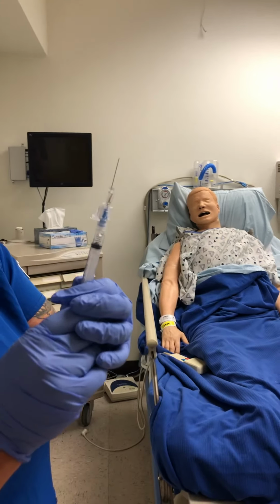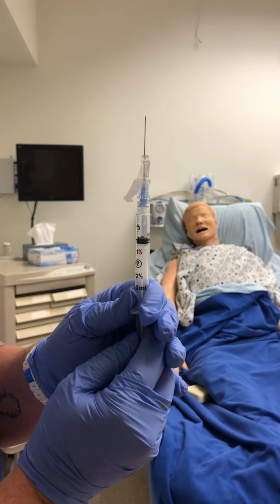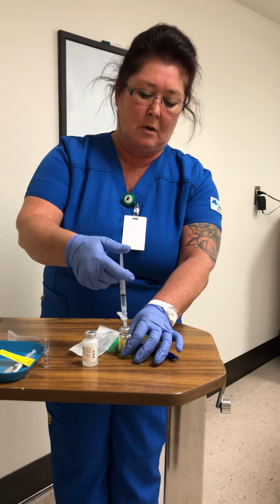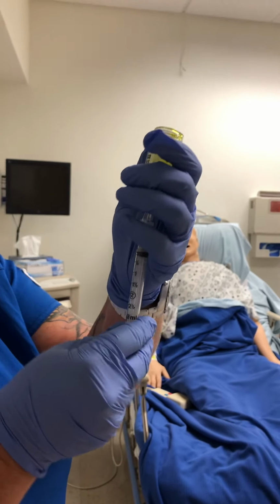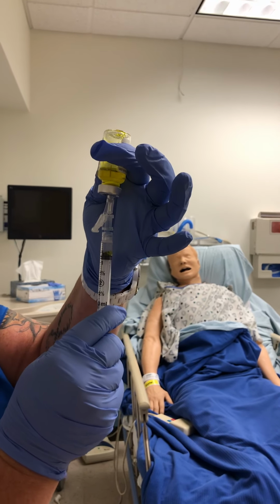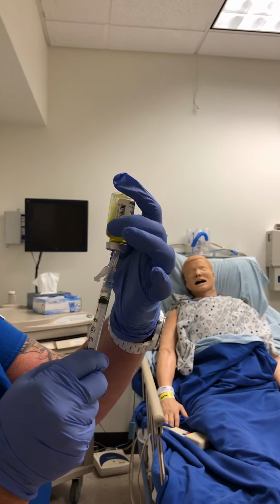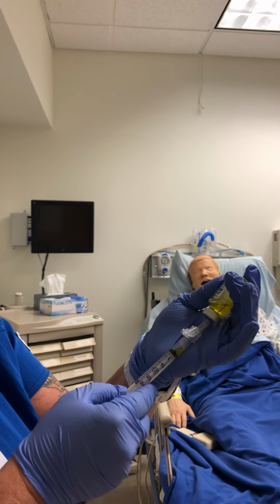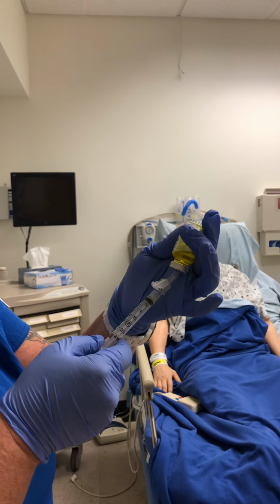So I'm going to draw back 1 milliliter of air. I am going to put it into my ceftriaxone. And now I'm going to draw back. I guess we're gonna tip so that we can get it all. I think it's the mixture. It is not wanting to come out.